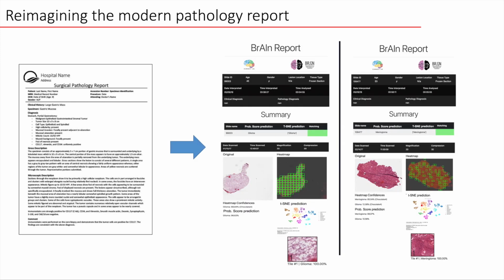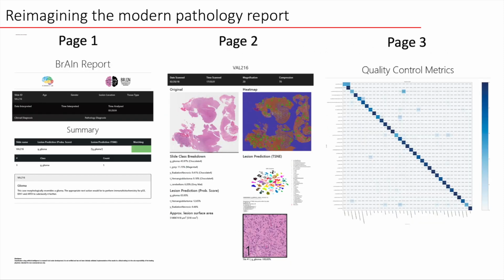But we think that by doing this digitization of the data and using these computational tools, we now have a much more visually appealing way to document our medical findings in a microscope and do this in an automated way. So we're trying to generate these reports that are automatically generated by computers, where physicians and pathologists can approve and confirm the findings, and it just documents it in a much nicer way. So this is one of our recent templates, just to show you we're always improving it based on feedback we get from pathologists and clinicians about what they would like to see on these pathology reports.